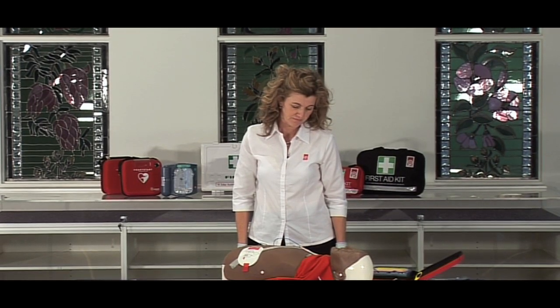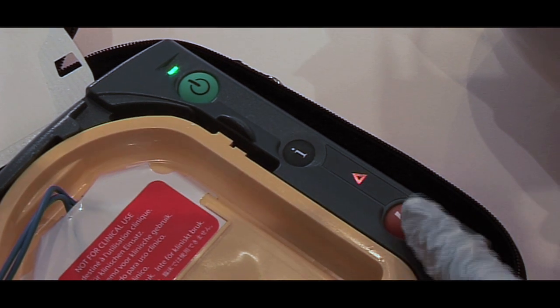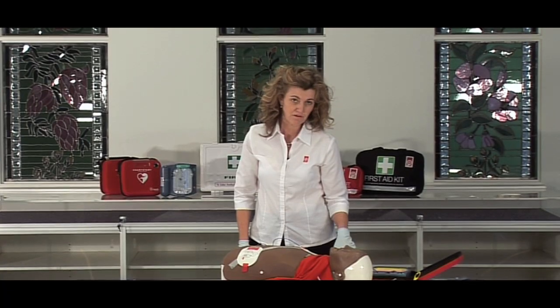Shock advised. Stay clear of the patient. Press the flashing orange button now. Shock delivered — you've defibrillated them.